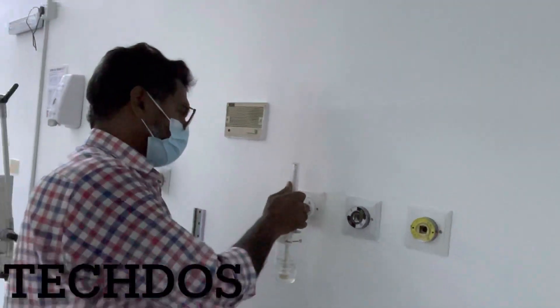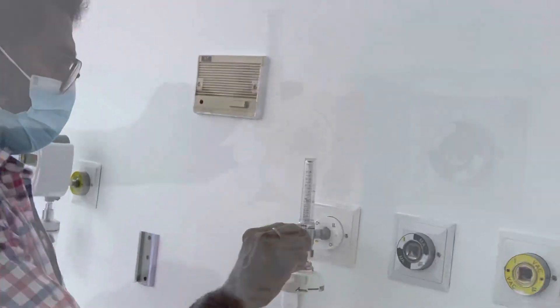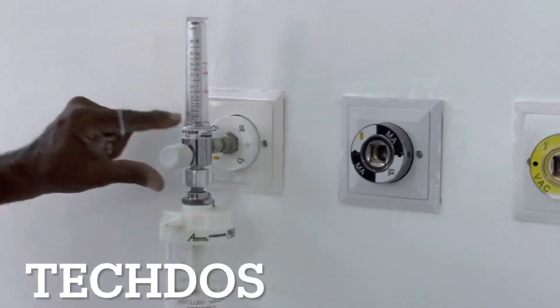Today's video is about the leaking oxygen outlet maintenance from the hospital.